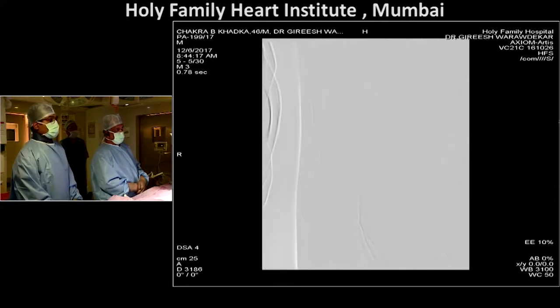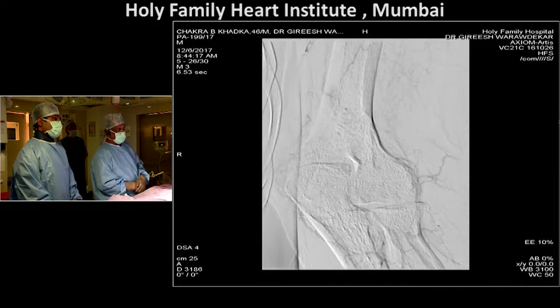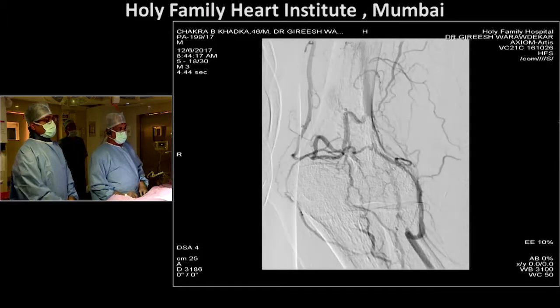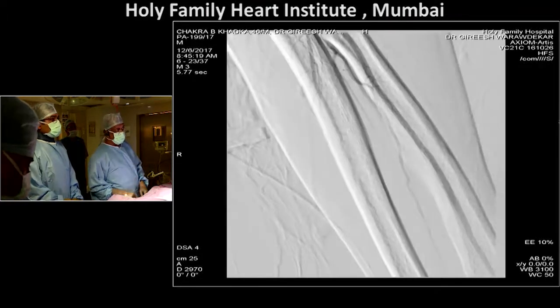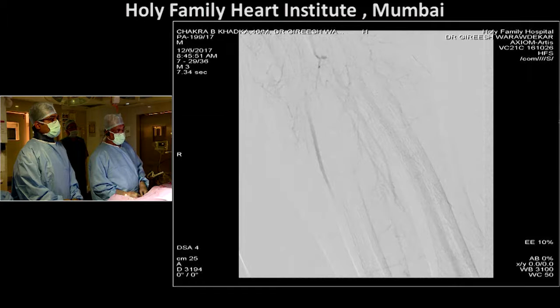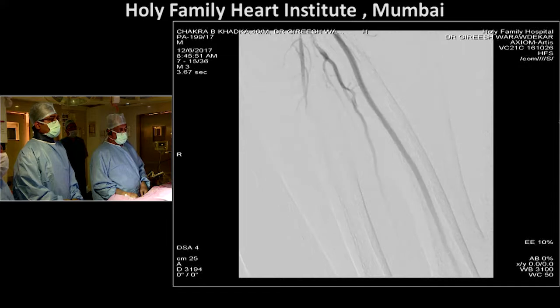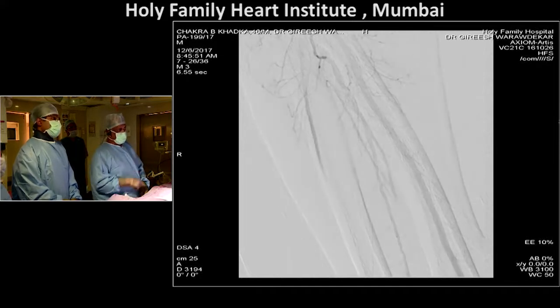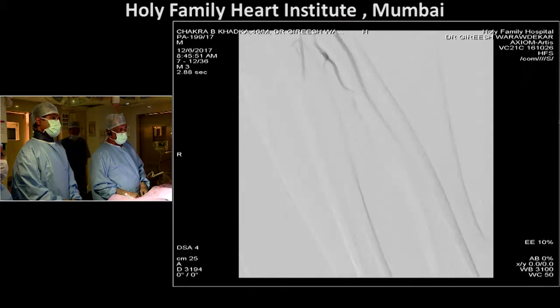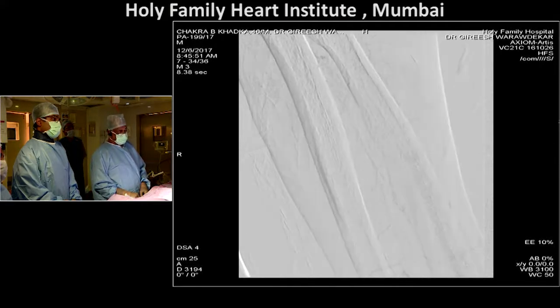But after I have plastied the radial, I don't see that. If you see the post, show me the next run, please. One more. Here is a good picture; you can see the ulna. But I don't see it filling in the first picture. What I am seeing in the middle is what I think is the interosseous. Yes, that's the interosseous, and the ulnar is on the side, which is small because of poor perfusion there. Correct. It's sluggishly going down.